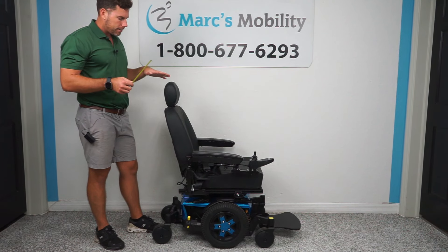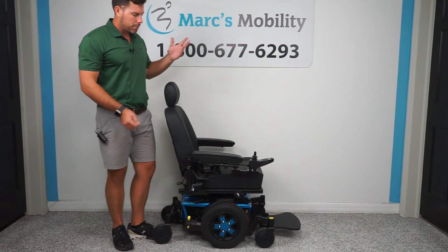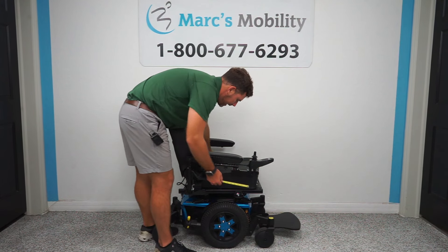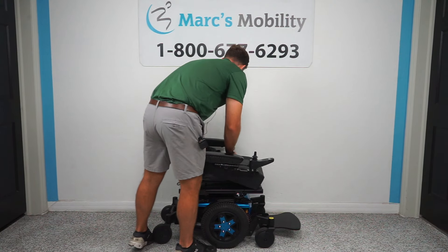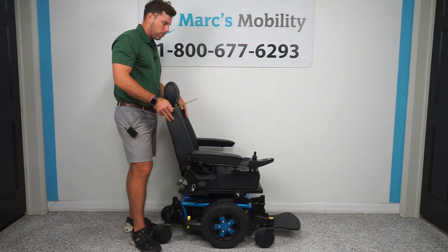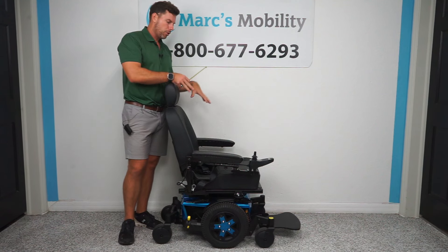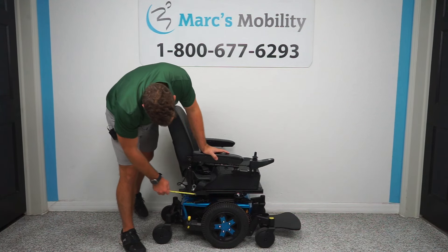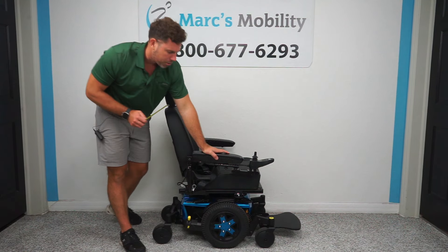It is going to come standard on this unit with a 20 by 20 seat. That is a pan seat, so this bottom cushion is removable. You are able to change the size of it down the road, but in order to do that you have to change the bottom cushion and order a whole different back. I would really buy this chair if you already want the 20 by 20 inch seat — there's not really going to be much adjustability on it. Maybe just a hair we can take off in the depth by sliding the seat forward, but in width there is no adjustment.